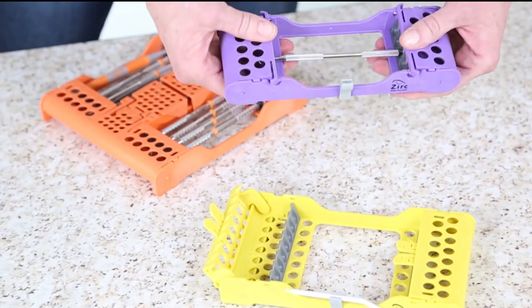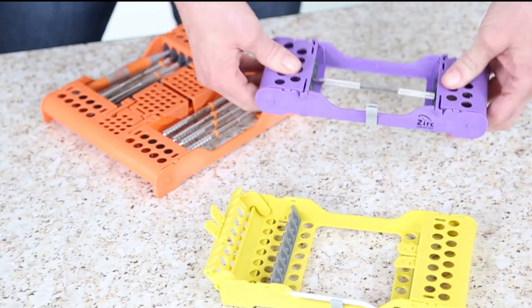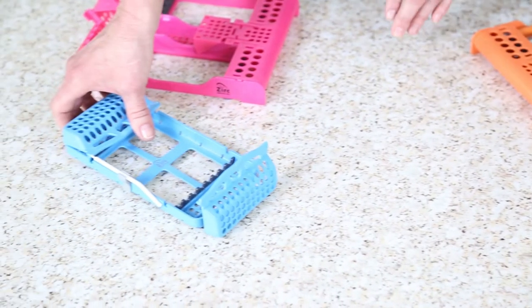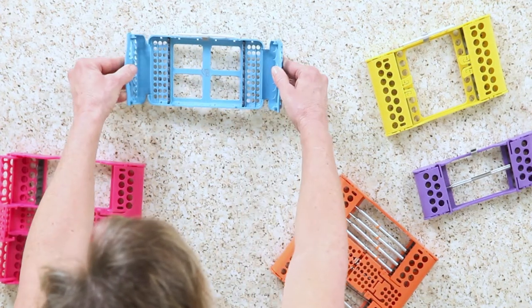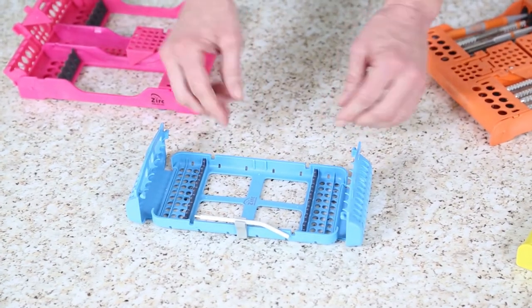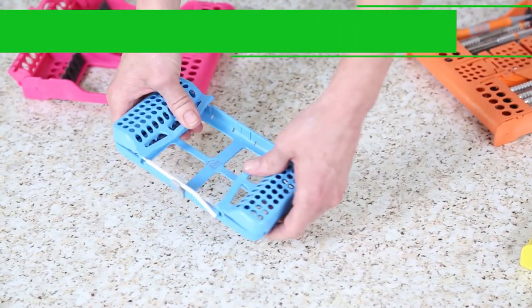With our original 8-place cassette, you simply have the locking tabs to open or close the cassette. The blue cassette here is an 8-place slim cassette. Compared to the yellow cassette, you can see it has a more petite profile, making it ideal for practices with smaller ultrasonic cleaners and autoclaves.